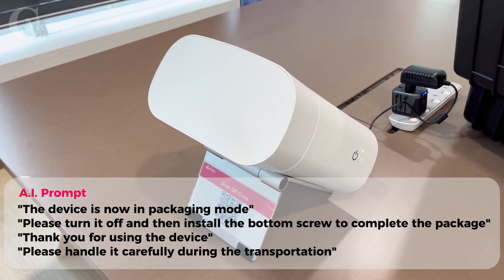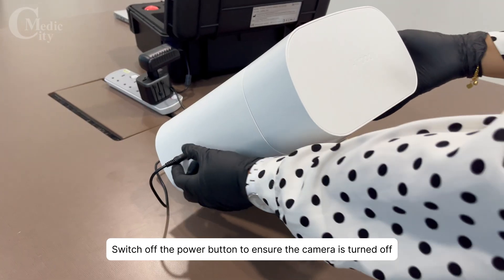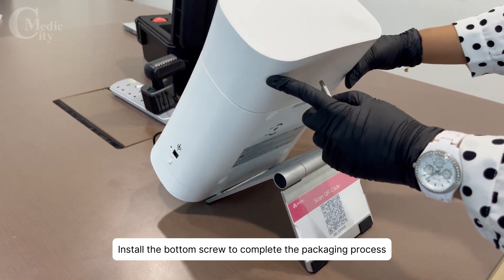Thank you for using the device. Please handle it carefully during transportation. Switch off the power button to ensure the camera is turned off. Install the bottom screw to complete the packaging process.